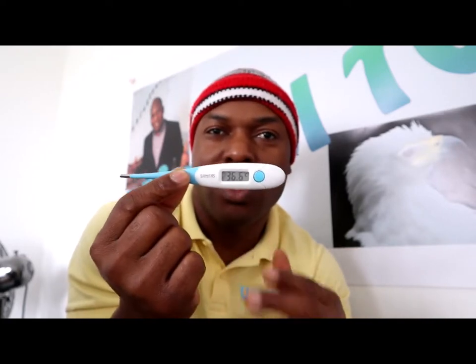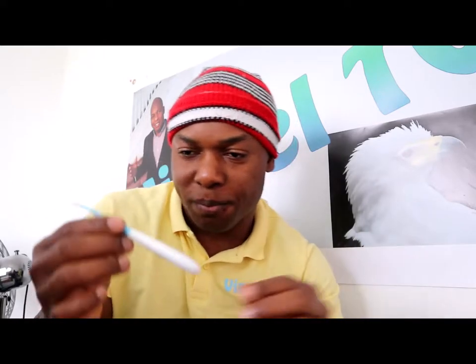But it's good to have this at home so that you'll be able to check in case your child or your children are having a fever. So you need to have this beforehand to make sure they are not having a temperature. If they're having a temperature, if that is above 37.5, you can give that person paracetamol to bring it down. Or I think ultimately you need to see your physician, a GP or your doctor.